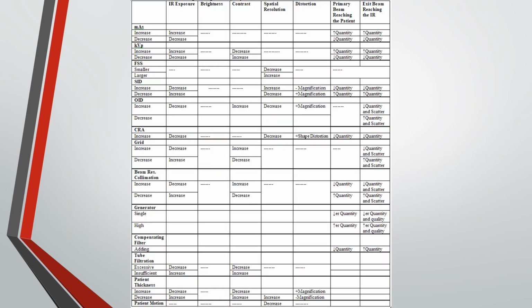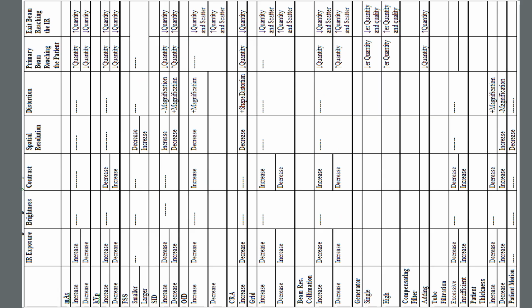This is a chart that really summarizes everything we've talked about in these last lessons. Take all that and use it when you are X-raying a patient. This is another look at the chart. I put it sideways because it may look better on your device; it's taking up more of the field of view this way.